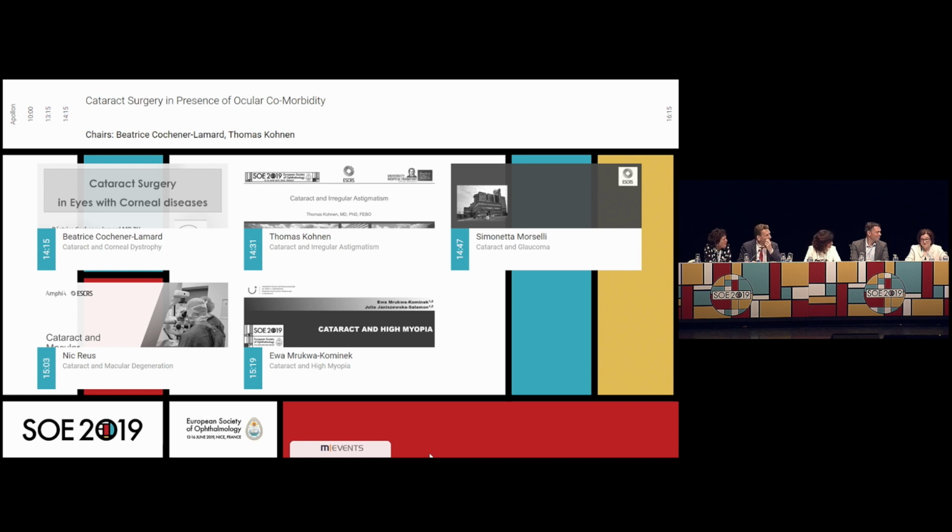What do you do? Yeah, this is really a problem, but nowadays we have really good devices. We have good phacoemulsification machines, so these machines now protect us. Before, it was much more common to have the fluctuations. Now you have the possibility to set your own parameters, and then you can lower the intraocular pressure and lower the aspiration and irrigation.